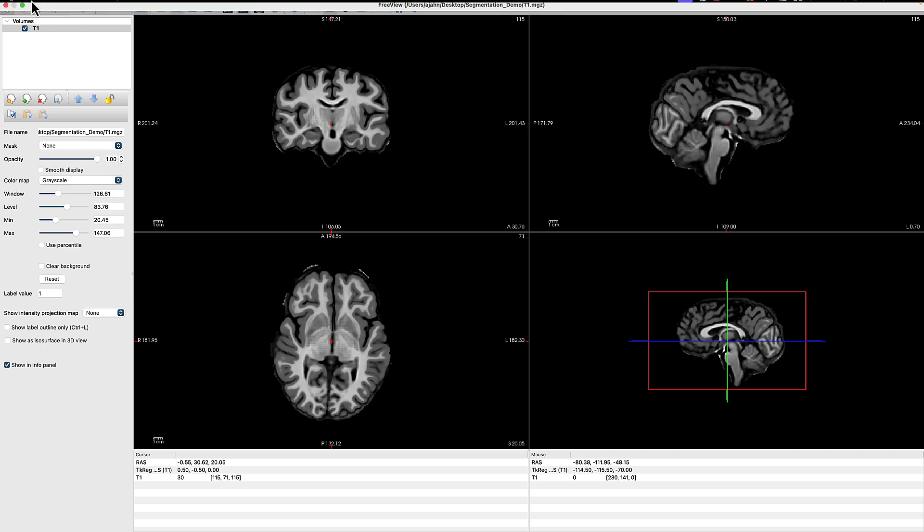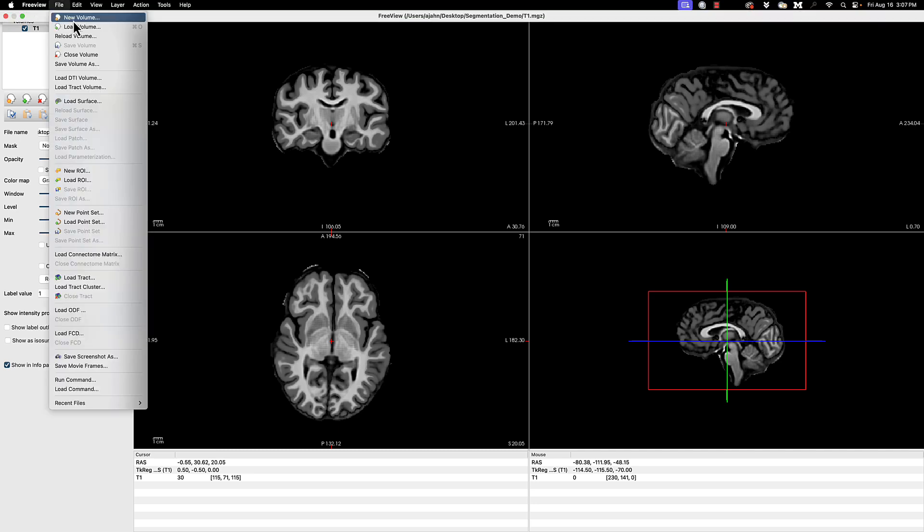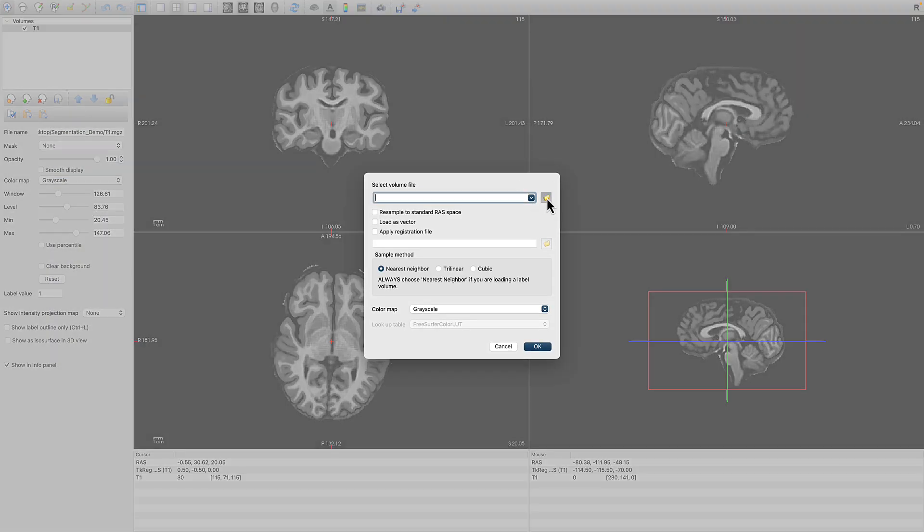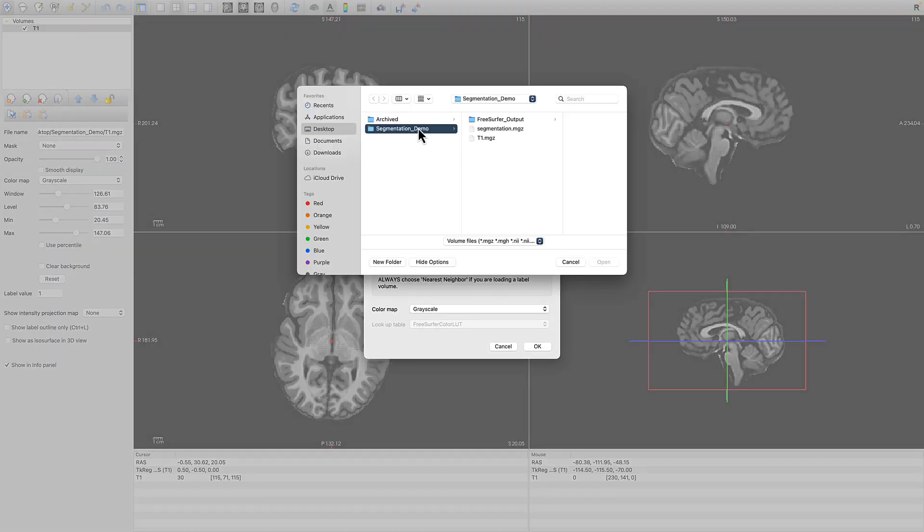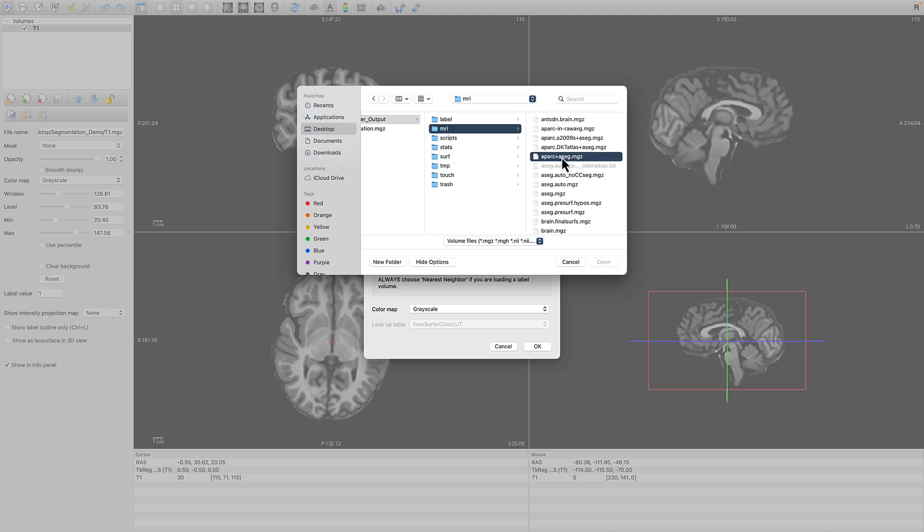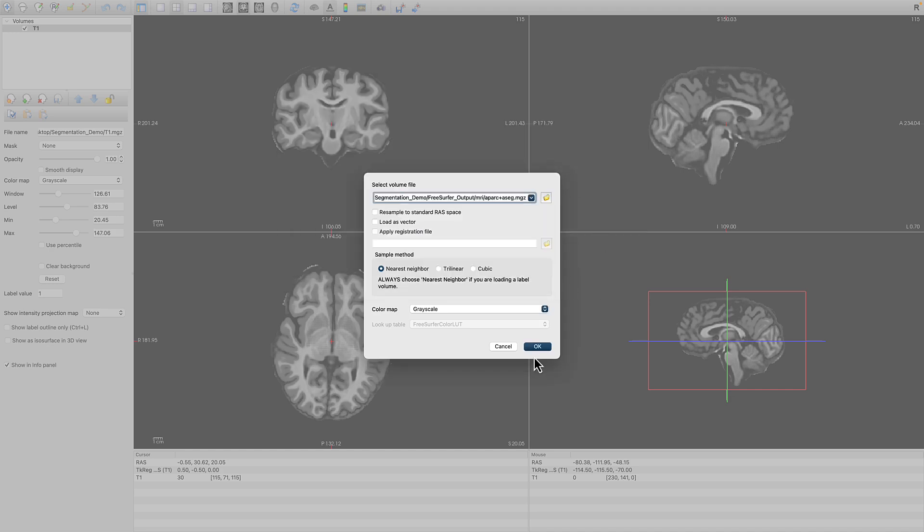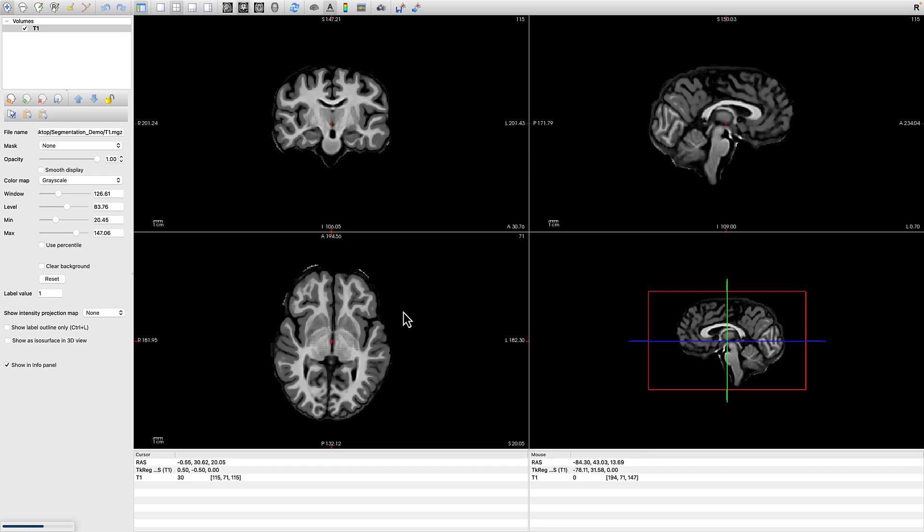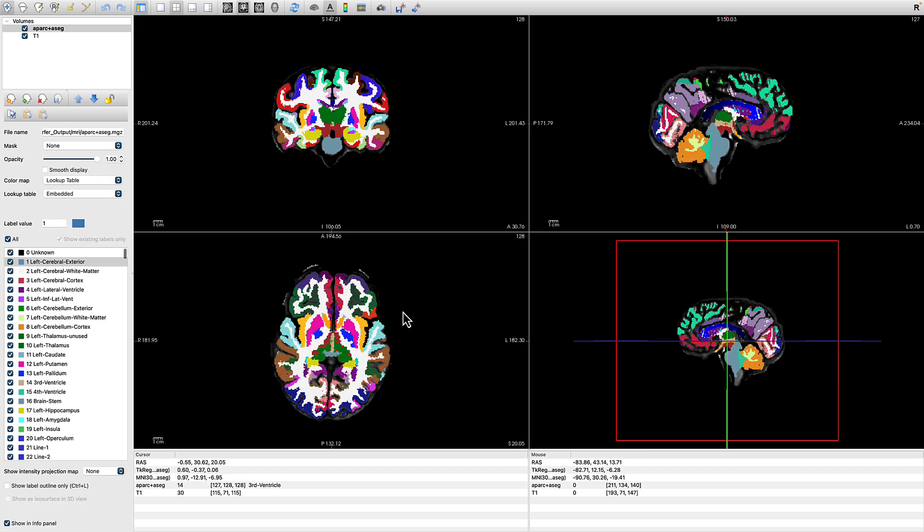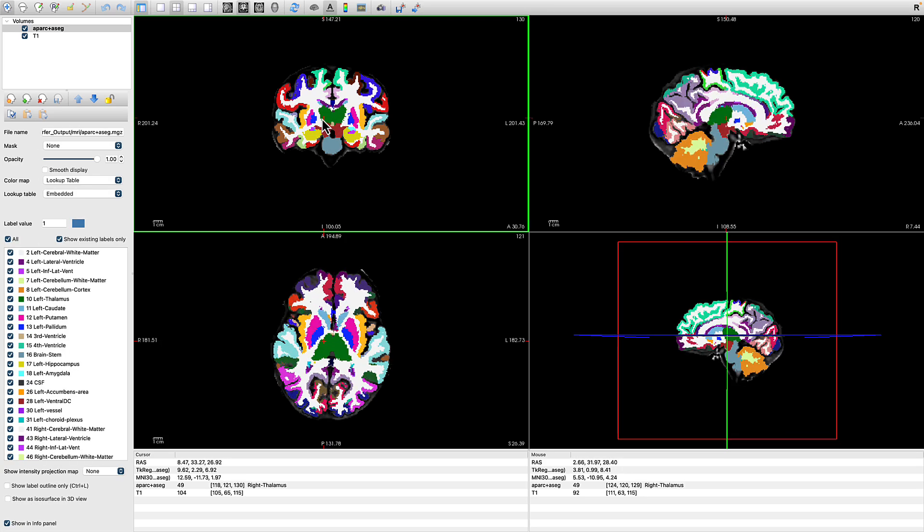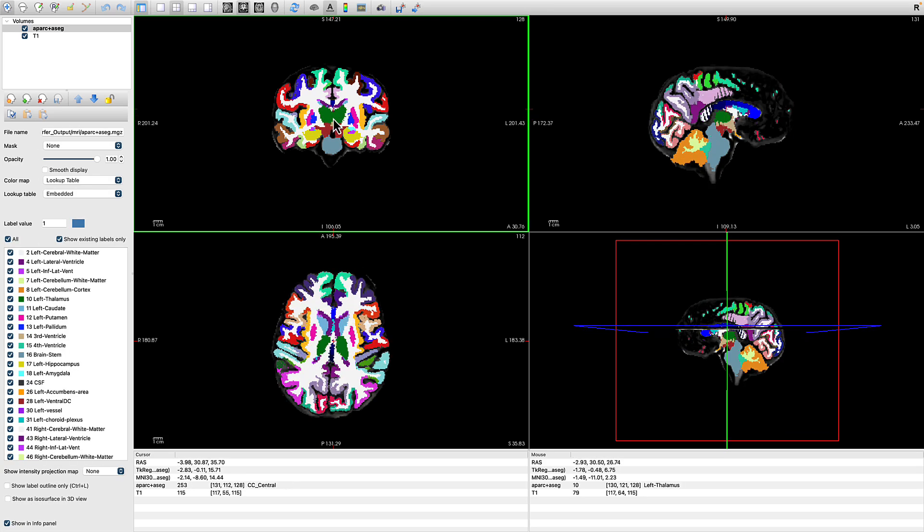You see all of the different orthogonal views. We're also going to load another volume, which is within the FreeSurfer output MRI folder, aparc plus aseg.mgz. We're also going to show the color map in the lookup table that comes with FreeSurfer by default. You can see all the different structures in the different colors.